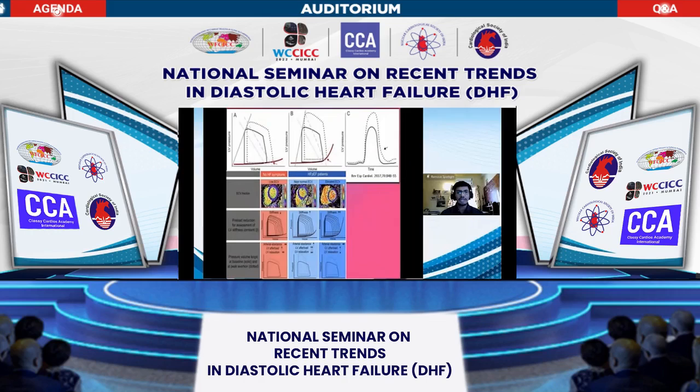What is diastolic heart failure? If you look at the pressure loops here, you will see that for the same given volume, compared to a normal patient, there is a sudden rise in pressure, and this is accentuated during exercise. Basically, this is a marked increased LV afterload, a decreased LV relaxation, and an increased stiffness. And how do we see it on MR? We have a wonderful tool called ECV, and we find that an ECV which starts increasing over time seems to be the real culprit in this whole diastology.